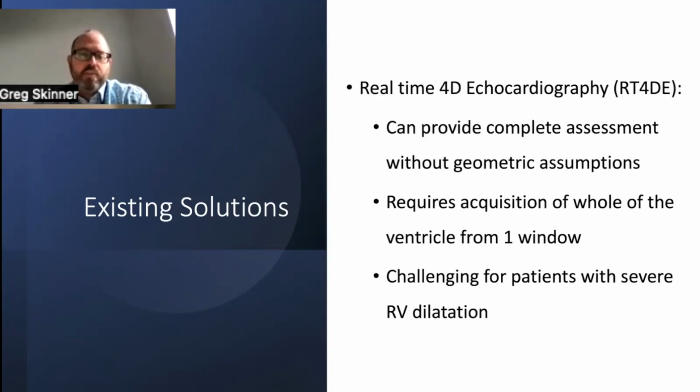And as I spoke to you before about real-time 4D echocardiography, it can provide a complete assessment without those geometric assumptions, but it's very, very challenging.